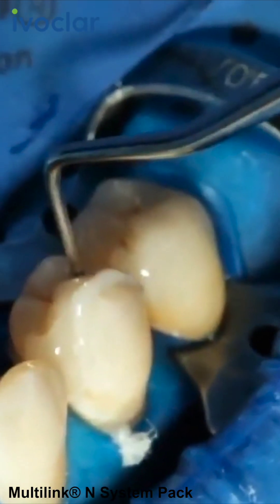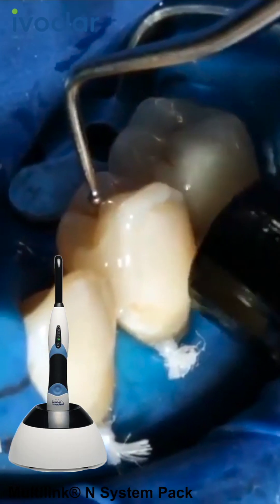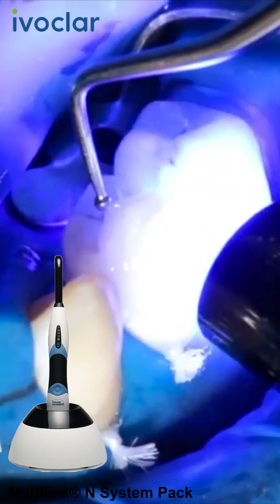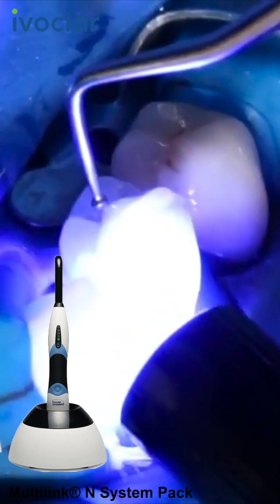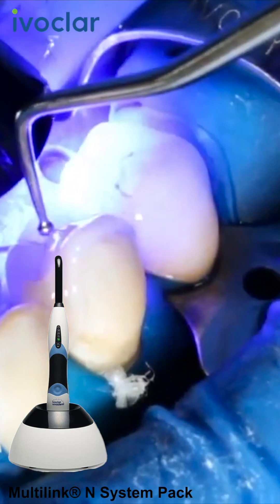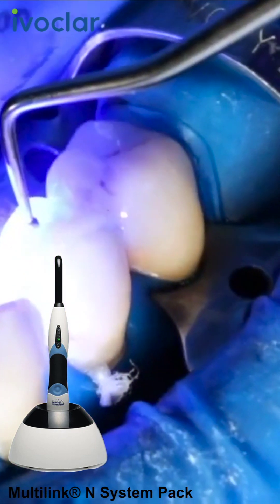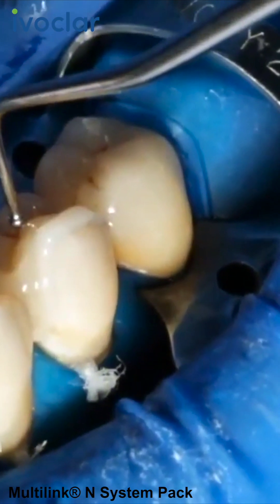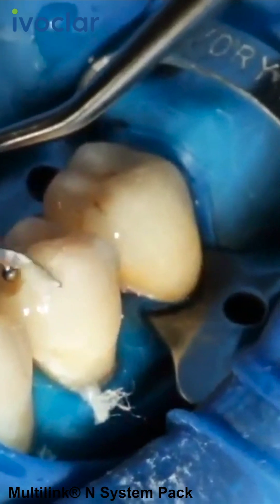Light cure excess cement with a polymerization light, such as Blue Phase N in high power mode, for 1-2 seconds per quarter segment using a light intensity of 1,200 mW per square centimeter. Note that the distance between the light probe and the restoration must not exceed 10 mm. You can now easily remove the gel-like excess using an implant scaler or dental floss for the proximal areas.